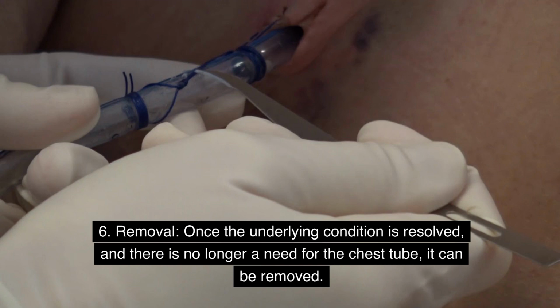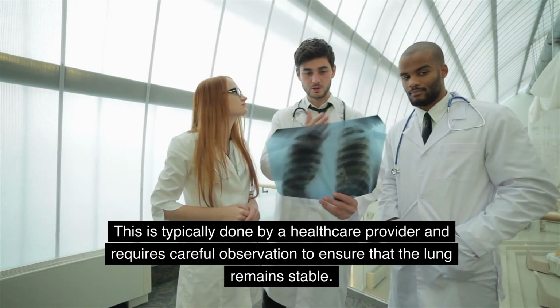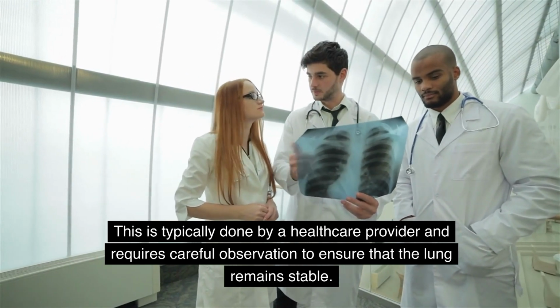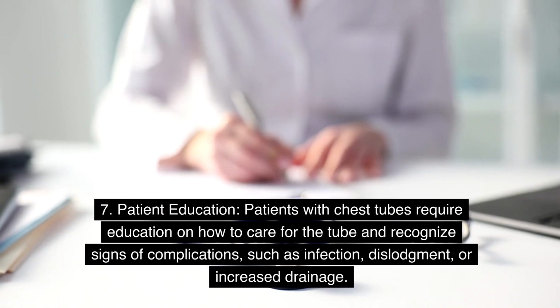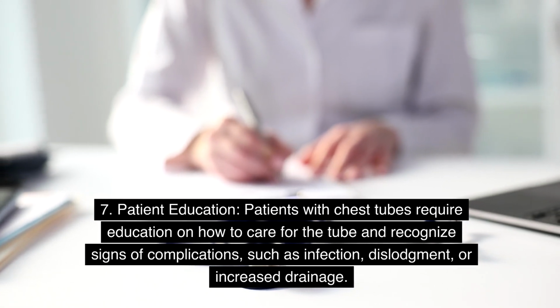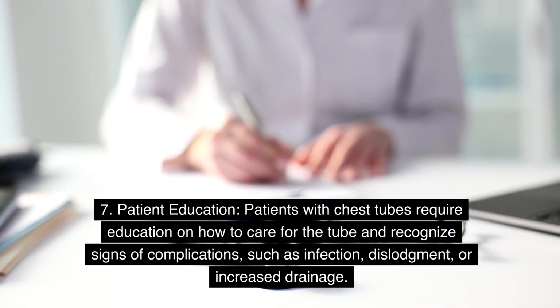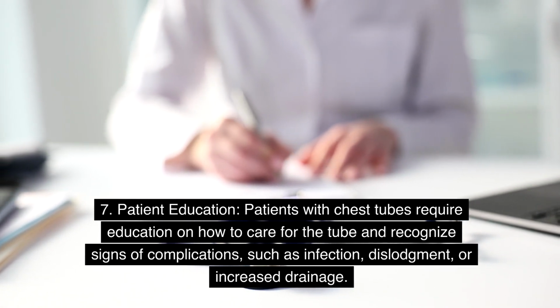6. Removal. Once the underlying condition is resolved, and there is no longer a need for the chest tube, it can be removed. This is typically done by a healthcare provider and requires careful observation to ensure that the lung remains stable. 7. Patient education. Patients with chest tubes require education on how to care for the tube and recognize signs of complications, such as infection, dislodgement, or increased drainage.